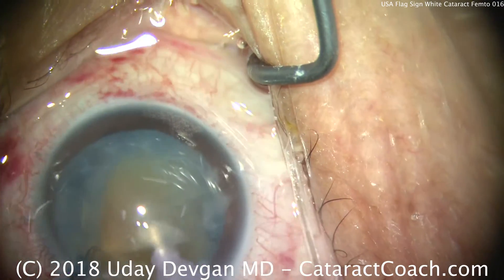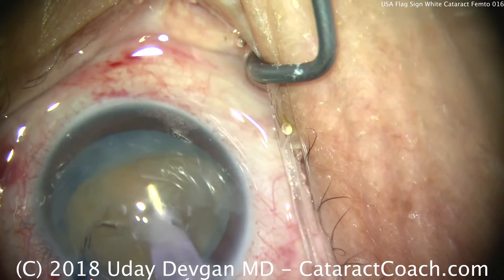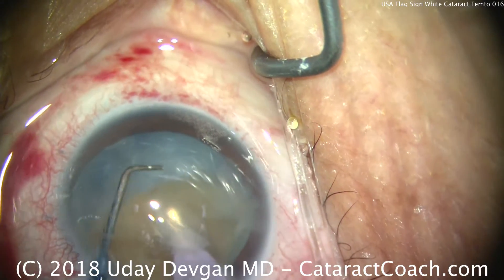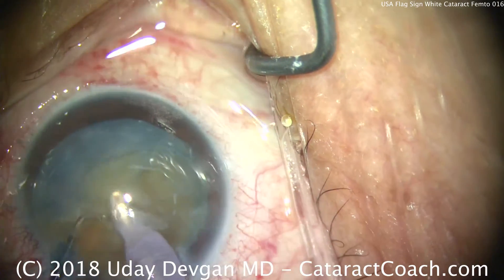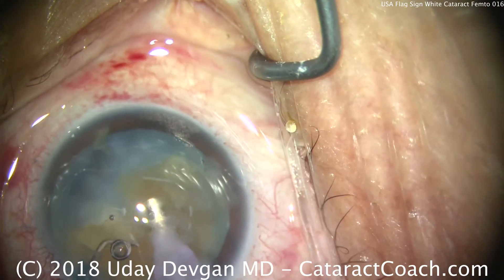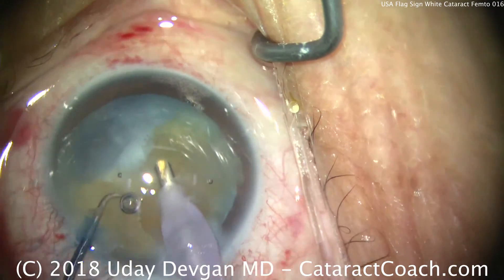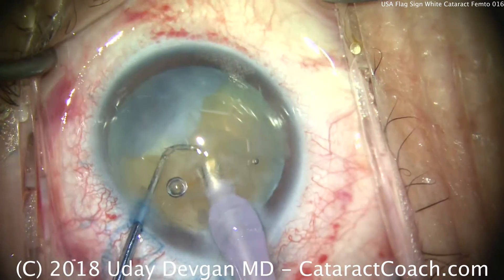And there we go — central chop. This lens certainly has a good degree of density. You'll notice that the nucleus is a little bit on the small side, and that's because of all the cortex that has been liquefied as the white cataract developed. This lens certainly had some degree of intumescence, or fluid, inside the capsule bag.